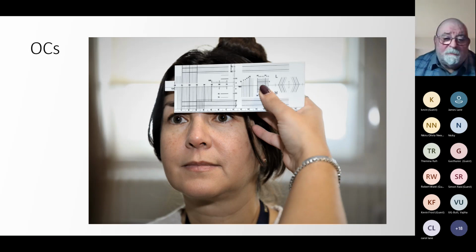And my colleague taking the measurements, Kat, is resting the ruler onto the bridge of the nose and pressing, not hard, but a tiny bit of pressure onto the forehead to keep the ruler steady. Kat's also got a couple of fingers on the side of the head, which again just helps to steady the ruler, and it stops any shake we might get.